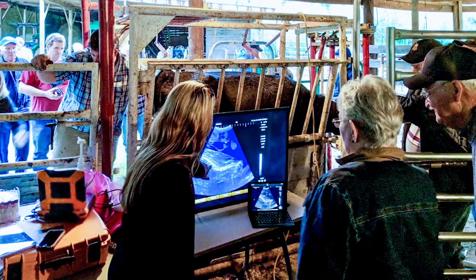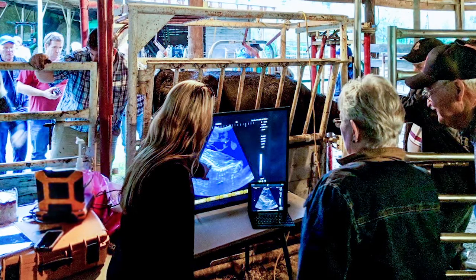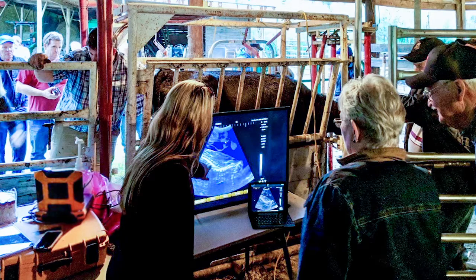Unlike its predecessors, the Evo screen, goggles, EvoStream app, and HDMI connection can all be used and viewed simultaneously.